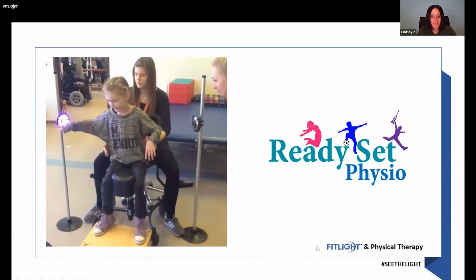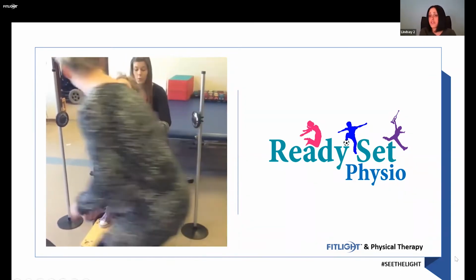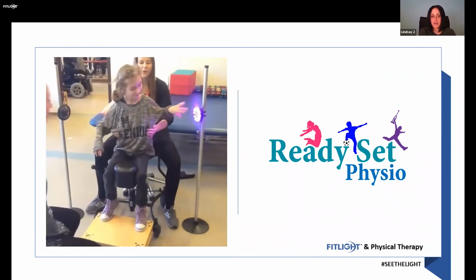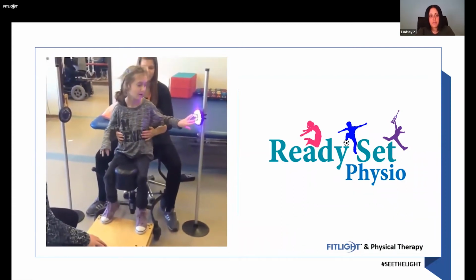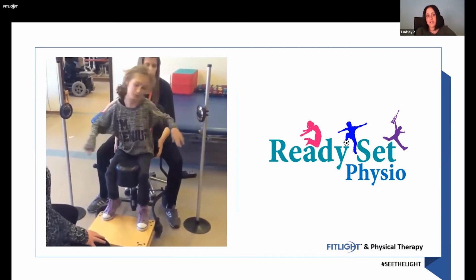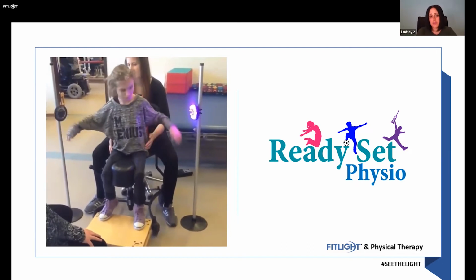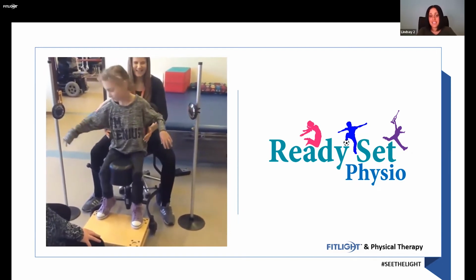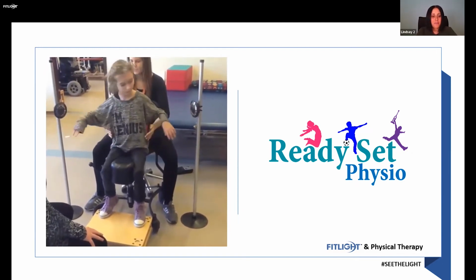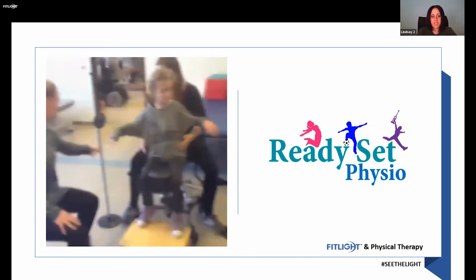And then, yeah, the pediatric population, also cerebral palsy or any of those other neurological diagnoses, the same thing about being able to now, that therapist sitting behind the child, guard them and not having to hold up any targets for them. And here, the child working just on some lateral movements, left to right, turning off the light, scanning, you know, just getting them to kind of pay attention and move towards that light.